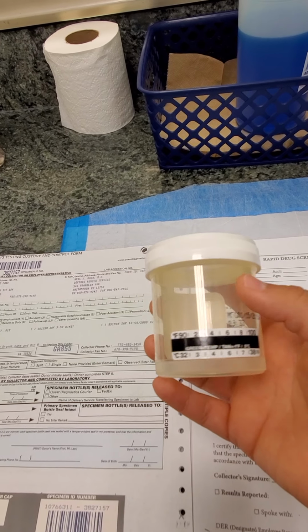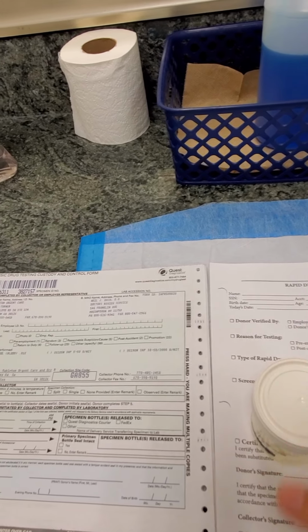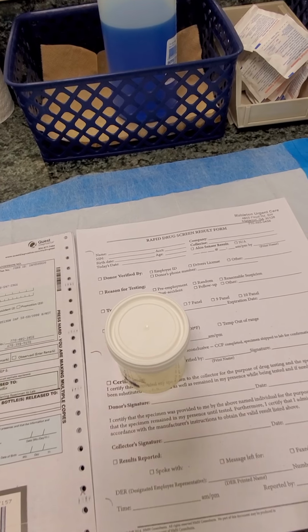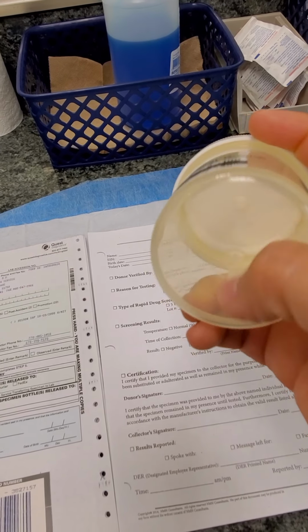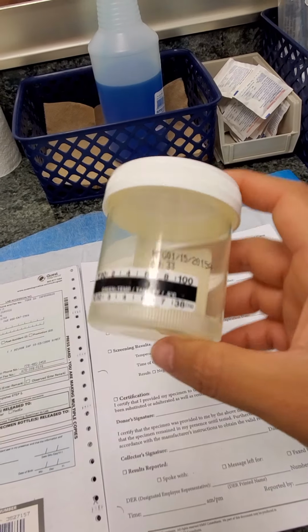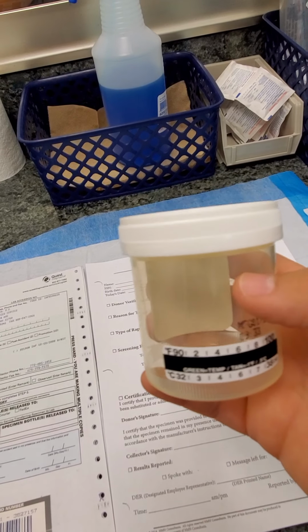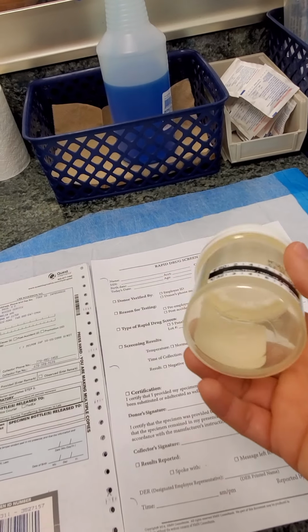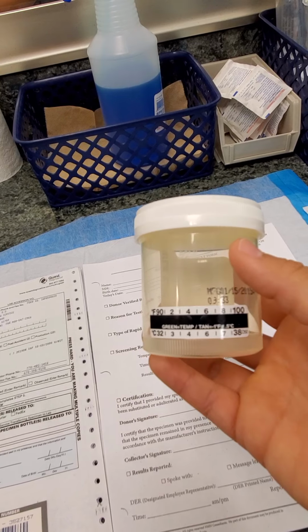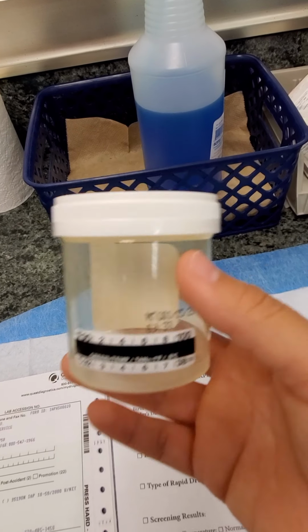But yeah, so you'll check the temperature. You also want to look on the inside and see if there is any oil floating, or if there is anything in the cup, like at the bottom, if you see any foreign body, like a powder substance. We've been doing a lot of UA collection, so we know what normal urine looks like. We know the characteristics. So if it's something unusual, if it has a chemical smell, if it has oil, it has stuff at the bottom, then most likely they have done something to adulterate the specimen, or they brought a specimen in a container that could have been oily, like a condom.